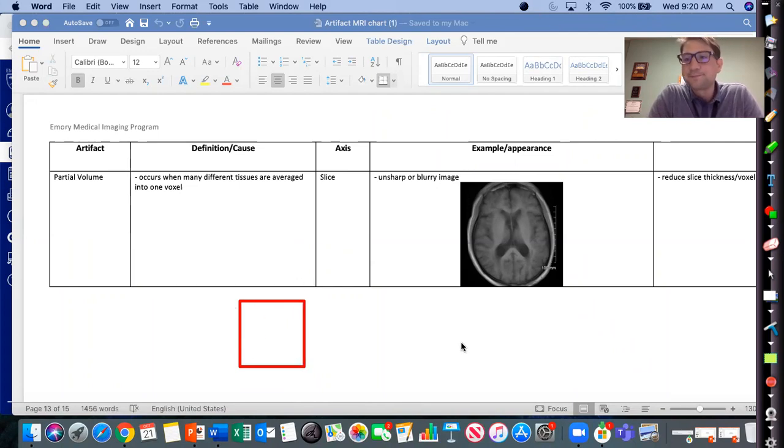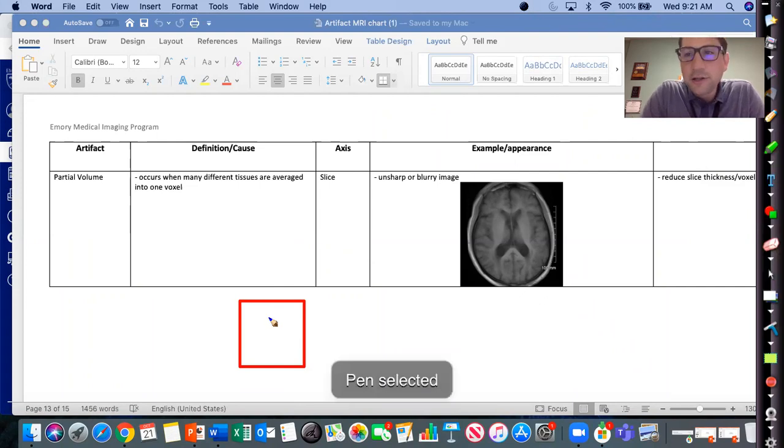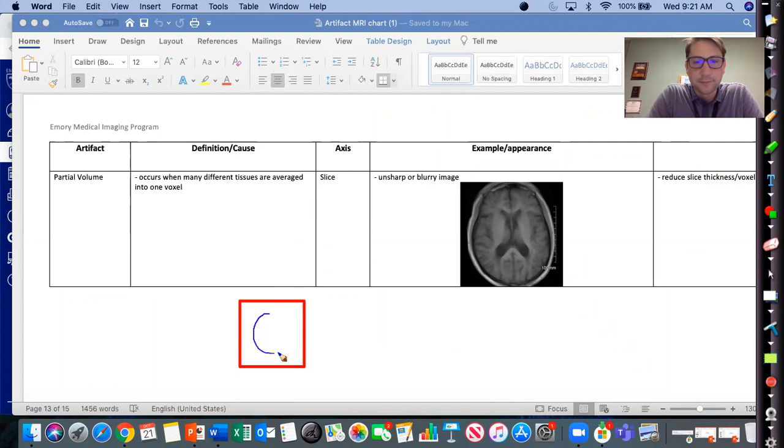This is a pixel. And let's say there is a small little tumor within that pixel. Let's say the tumor is about this big. Okay? So to get a certain signal intensity from this pixel, we have the tumor that's blue, and then the white area is just normal brain tissue, let's say.